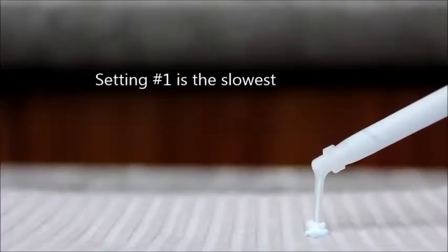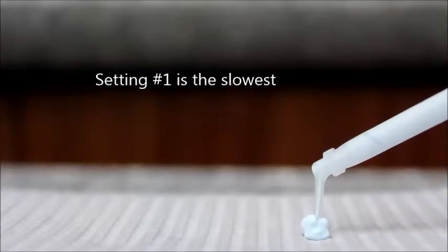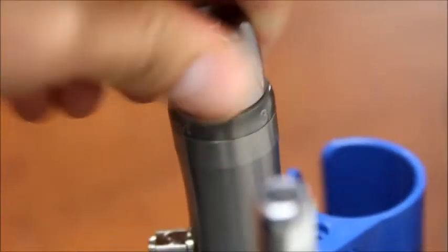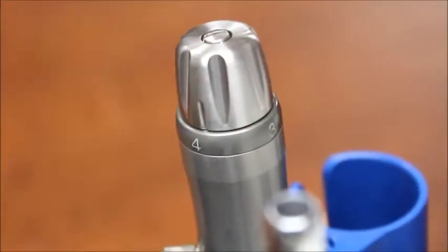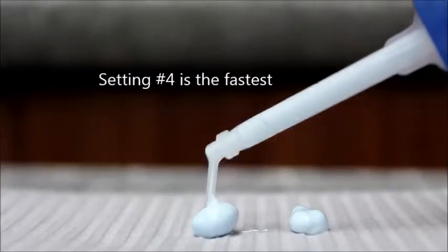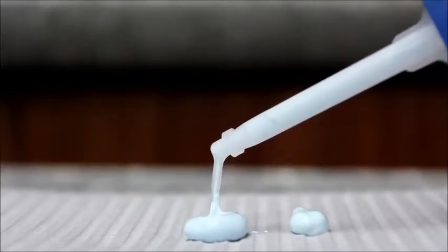The extrusion speed of the impression material is controlled by the regulator. Setting number one is the slowest extrusion speed, and adjusting the dial to setting number four will produce the fastest extrusion speed. I recommend starting with the slowest extrusion speed until you are comfortable with the system.